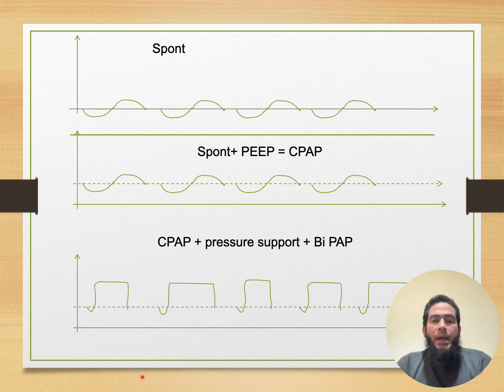It's really important to understand here that with pressure support, you don't control the rate. So with BiPAP and CPAP, you don't control the breathing rate. Unfortunately, I still find some of my colleagues who misunderstand this point. For example, if you are putting on a patient who is in COPD exacerbation with raised CO2, and you want to wash out the CO2 to adjust the pH instead of having respiratory acidosis, they increase the breathing rate or the respiratory rate on the NIV or the non-invasive machine.